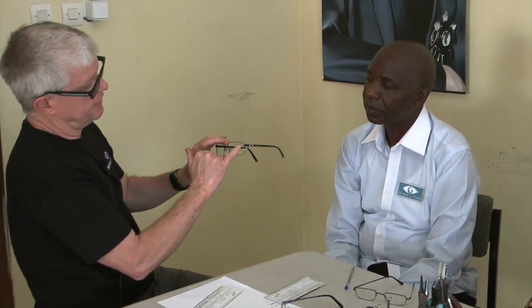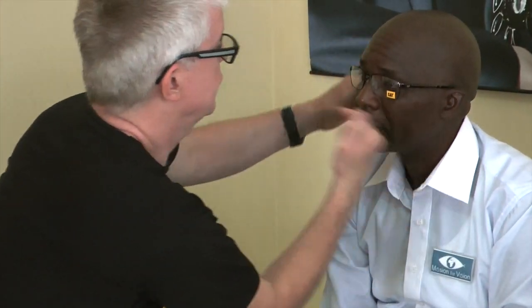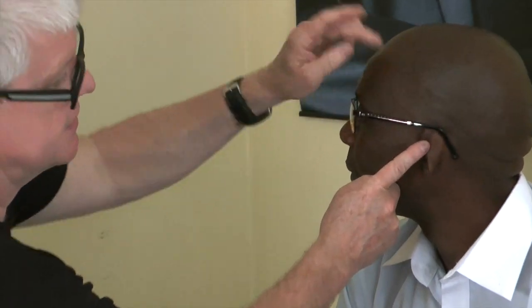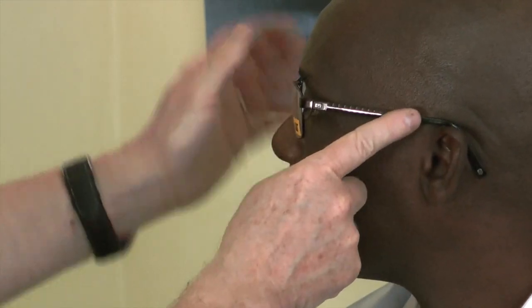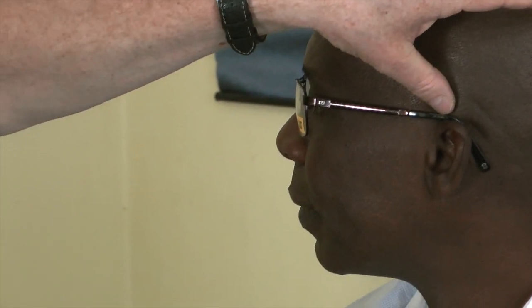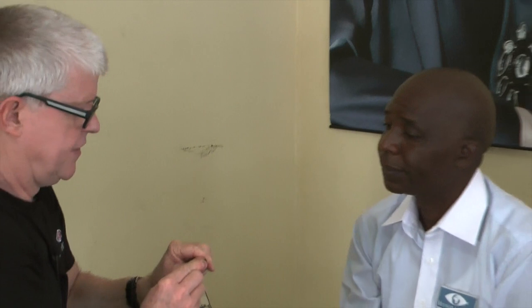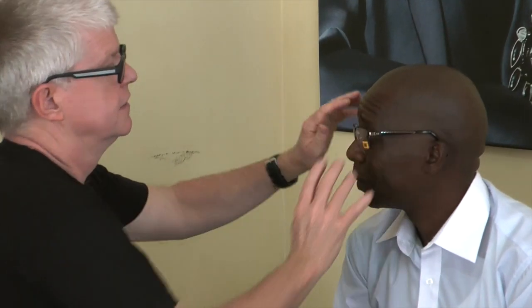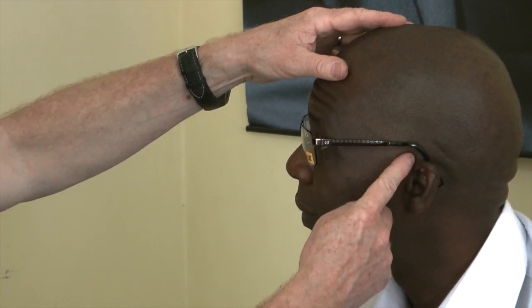I've made the sides shorter now. If we place that on Remy — you can see that the side is now corresponding to the ear. The side is sitting nice and flat on the top of the ear. If it was too short, like if I make this side too short and put that on, you'll see what happens — you've got the sides sticking up, and that's wrong.